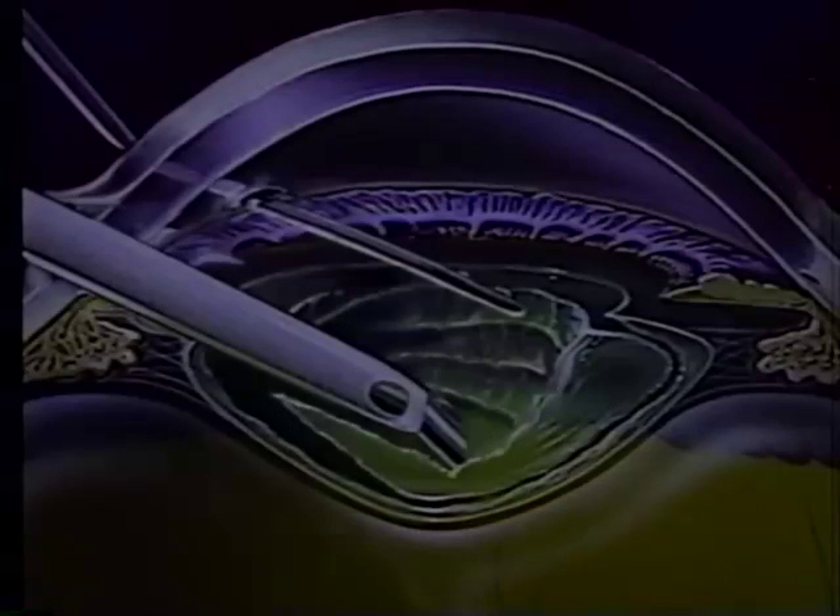Using the 30-degree Kelman bent phaco tip, multi-directional divide-and-conquer is begun by debulking the superior part of the lens. The nucleus is stabilized with a spatula for the first initial sculpts, then the second instrument nudges the nucleus inferiorly towards six o'clock. Downslope sculpting in the upper portion of the lens is done to just past the center, reducing the chance of posterior capsule rupture with the phaco port. Downslope sculpting facilitates getting two instruments deep into the center of the lens in order to fracture through the naturally occurring radial fault lines.